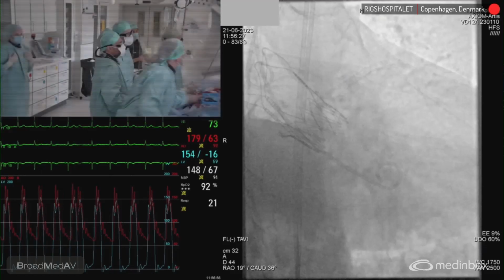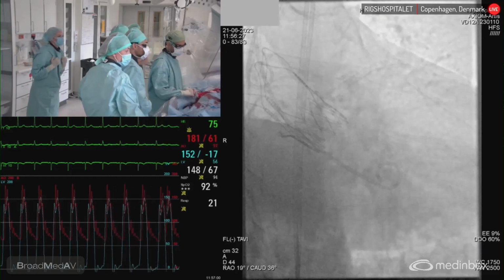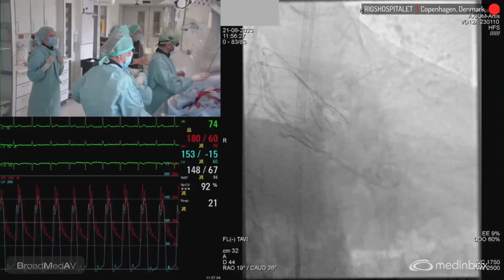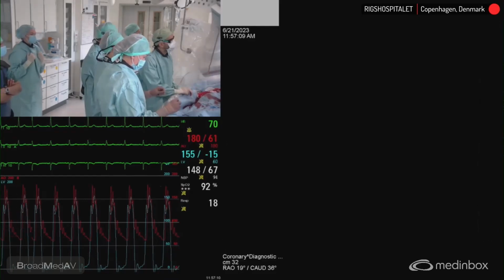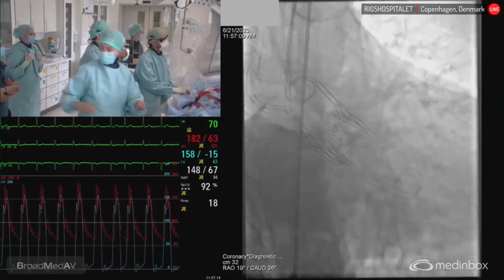Yeah, let's take it. It's 8. That looks very good. Pressure looks very good, and diastolic separation is better than it was. No gradient. So let's check it. I think we're done with the valve. Let's check it, Alejandro. Cool. Okay, do you print the pressures? Yeah, I don't think there's any leak.